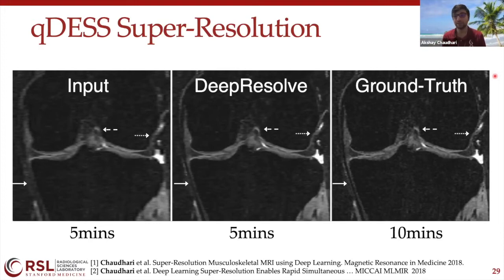And in addition, we can also have these measures called data consistency measures. Essentially, to make sure that we're not creating new image features or new artifacts, what we see in our images has to be consistent with the acquired data. And because of this consistency enforcement, we're not introducing too many more artifacts. But once again, like I mentioned, these are pretty advanced computer vision methods, and there's new literature coming out with better ways to train this, and we're always thinking of new ways to make our systems more robust.